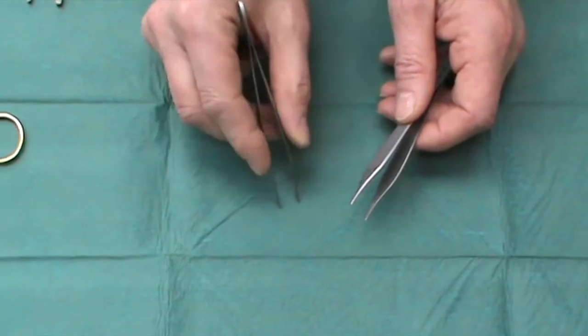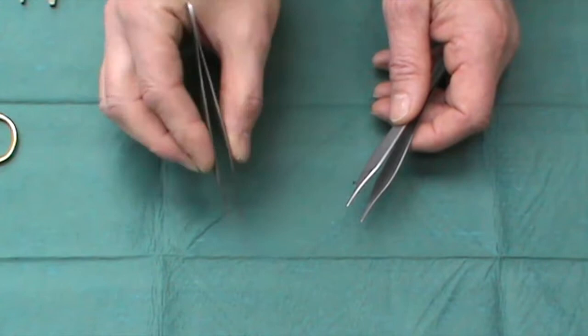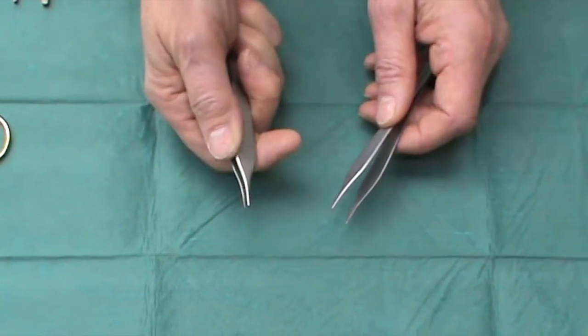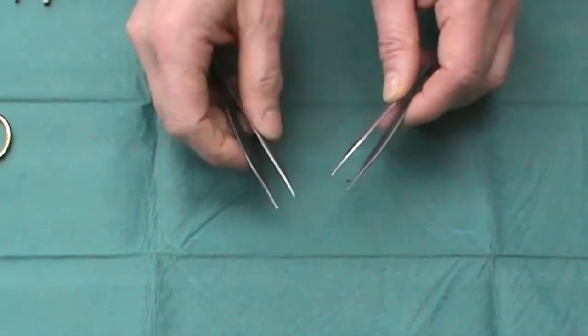They have the advantage that you can hold them in this very delicate way to manhandle tissue. Not to be used gripped like this or rotated, since that will damage their fine ends.